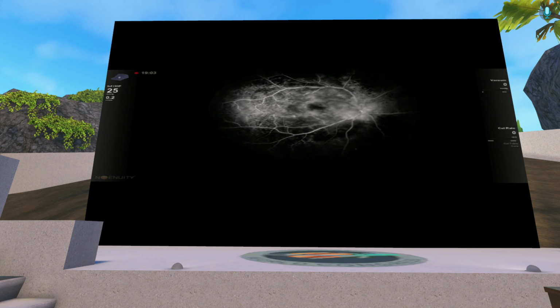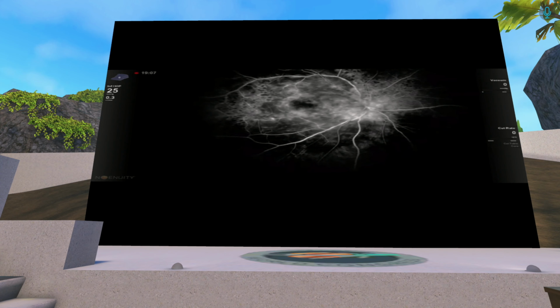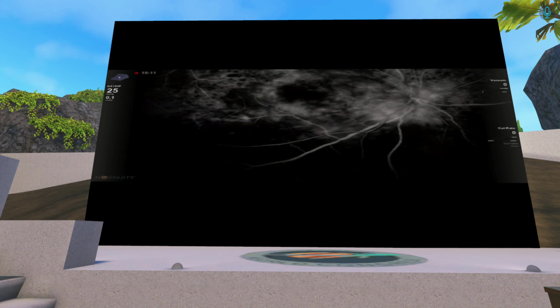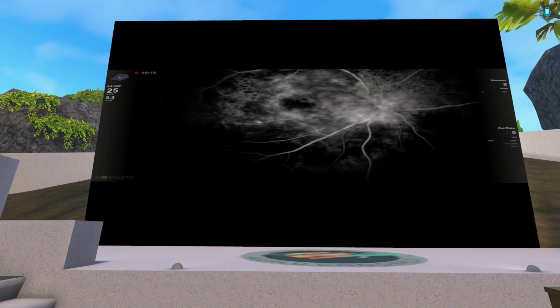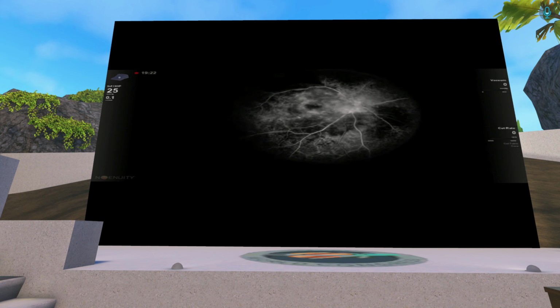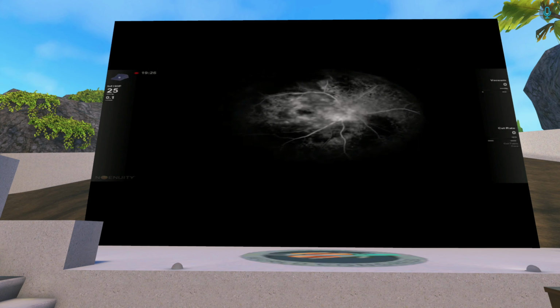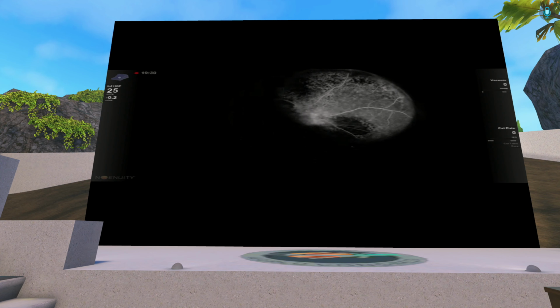So I also played a lot with the different colors of the image, but I do believe that we need to stay to the classical black and white representation of the fluorescein angiography that we are used to see from the fundus cameras and SLO devices, because it's more natural and we don't need to translate what we are already used to see in the classic FFA image.